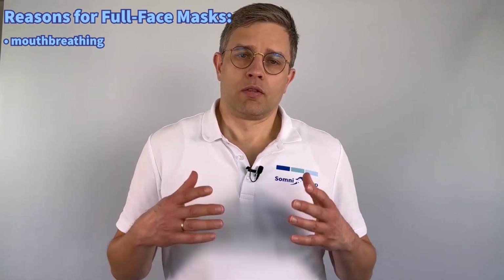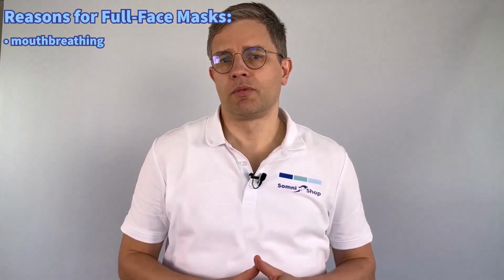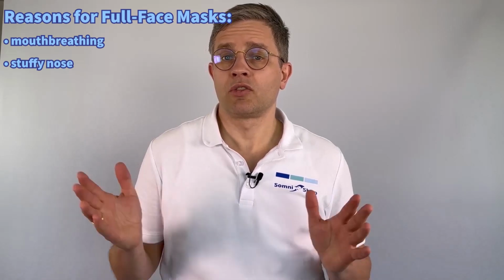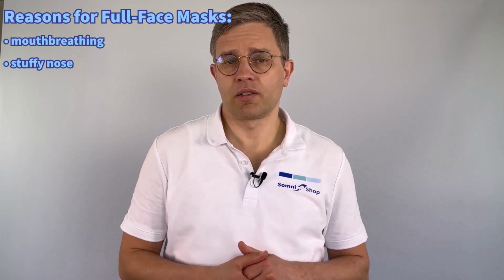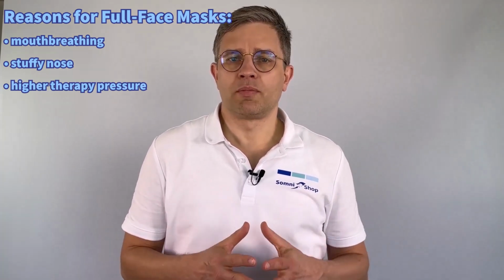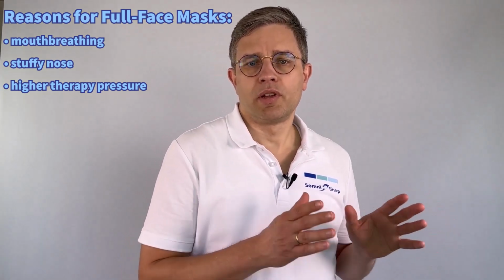When should you use a full face mask? There are three common scenarios where a full face mask might be the better choice. First, if you breathe predominantly through your mouth. Why? Mouth breathing can cause the pressurized air from the CPAP device to leak out, reducing its effectiveness. Second scenario, if you frequently have nasal congestion. Allergies or colds can block your nose, making it far harder to use a nasal mask. And the third scenario is if you require high therapy pressures. Full face masks distribute the pressure more evenly compared to nasal or nasal pillow masks.